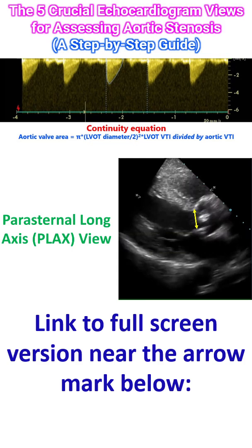The LVOT diameter is measured in mid-systole from the inner to inner edge of the septal endocardium to the anterior mitral leaflet, usually 0.5 to 1 cm proximal to the valve. A small error in this diameter is squared in the area formula, so take multiple measurements to ensure accuracy. Some have recommended measurement at the annulus rather than 0.5 to 1 cm proximal to the valve.